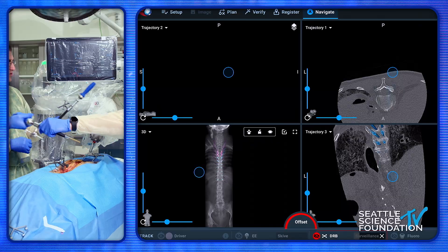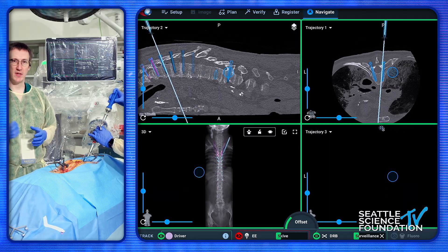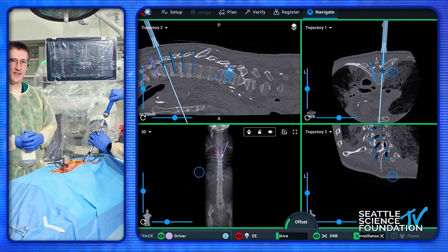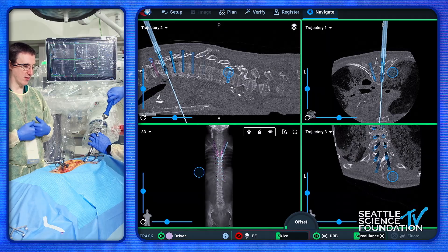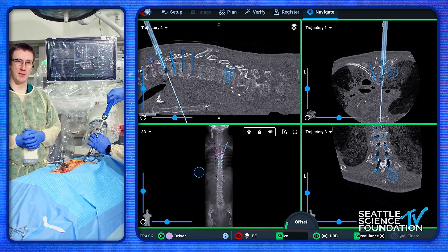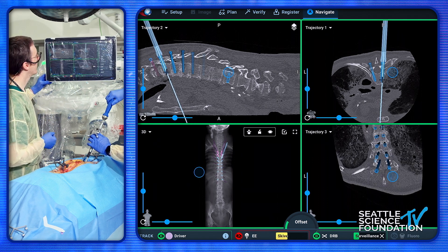What's nice about this particular screen is that the technician can see what screw you're going to use and preload it for you, ready to hand you, then get ready with the next screw as you move to the next trajectory. I do prefer to use a headless screw system — that way they're out of my way when I'm doing my bony work, whether it be a laminectomy, osteotomy, or the like.